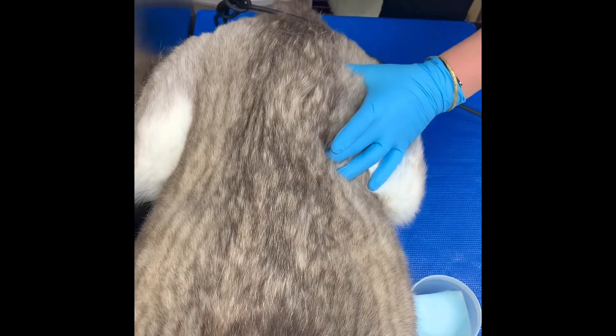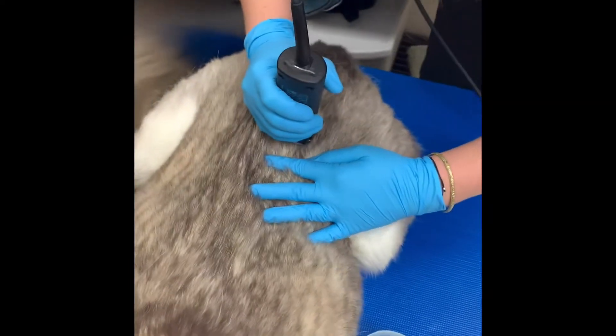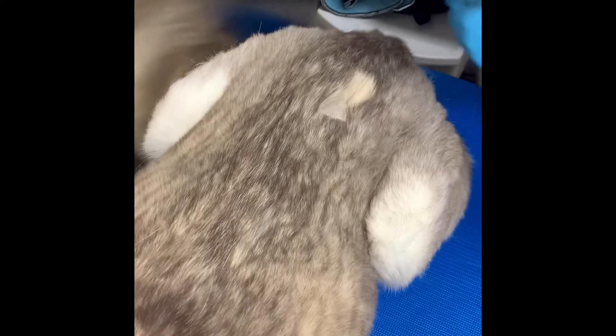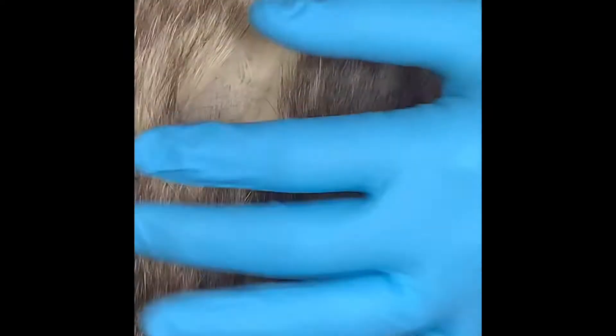The pet is previously anesthetized, then once they're comfortably placed on a table, we shave the area so that we can scrub and make sure that it is safe and ready for the injection. Here you see the technician scrubbing.